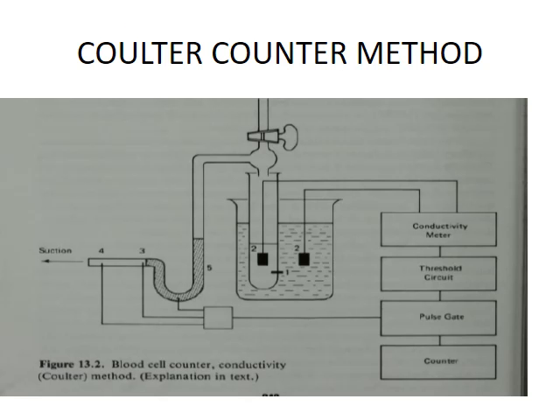One of the methods for blood tests is called the Coulter counter method, which is used for measuring the count. It makes use of the fact that blood cells have a much lower electrical conductivity than the solution in which they are suspended. It contains a beaker with the diluted blood into which a closed glass tube with a very small orifice is placed, as shown and marked as 1.